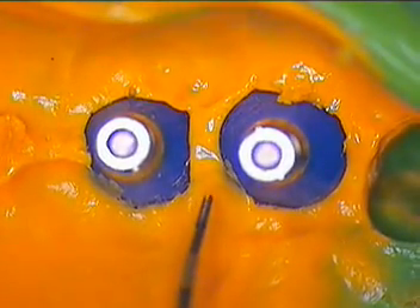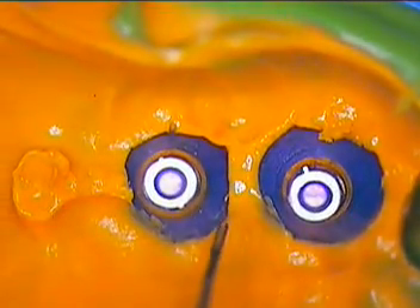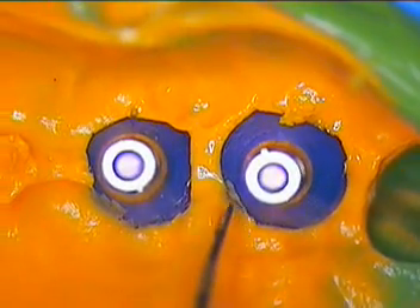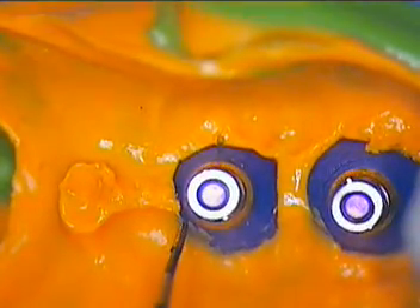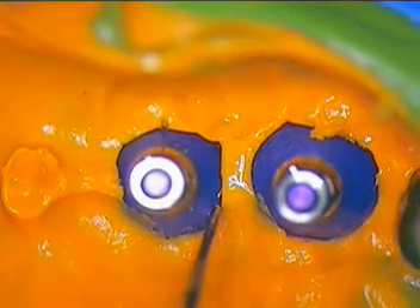You can see how we make the abutments so crystal clear and perfect for the try-in. You can see how much time we're actually saving during this technique. Time is our most valuable commodity in our practice, especially when it's coming from the lab — we want that to be perfect for us chair-side.